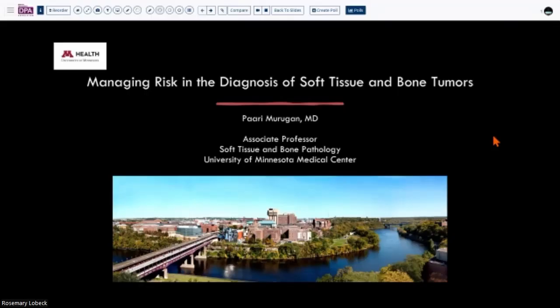Hello, everyone. Good afternoon. So I'm going to try something a little bit different this time around. This is the online platform for the Digital Pathology Association. I was going to go directly into their platform. This is unique because I don't know if some of you have been exposed to this before, but it lets you integrate PowerPoint presentations along with WSIs. So let's try it out, and please forgive me if there are any technical glitches because I haven't tried it on the big screen before this.